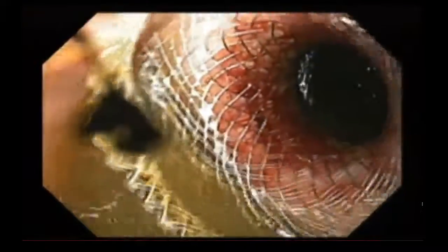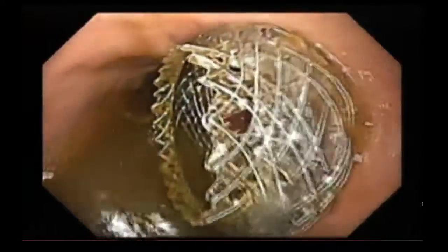And I would recommend in 1 month he come back for a CT scan, confirm that the cyst is collapsed and gone, and then Dalton can go and put the snare around the end. So it's very easy to remove. Take a big snare and put it around, or take a forceps, a rat tooth forceps, grab the end and just pull it out. Comes right out.